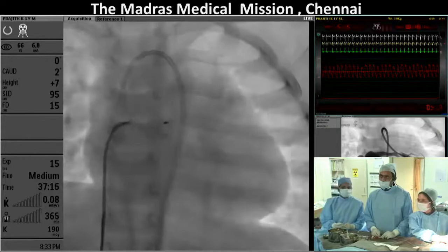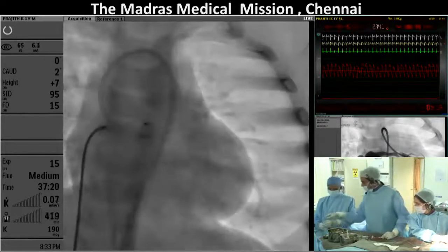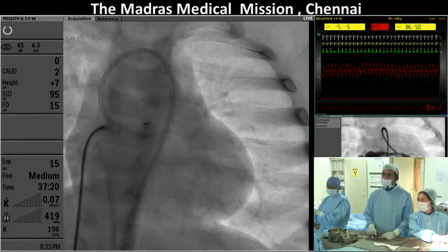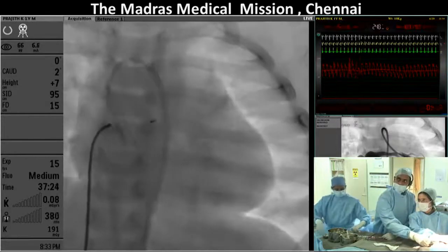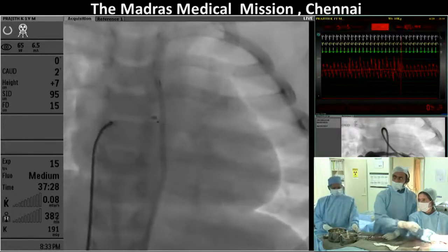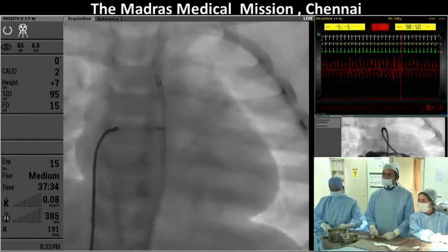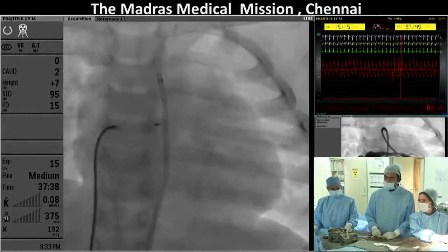I'm getting a coil. That's softer. Okay. Shiva, Jim was suggesting that the aortic catheter be pulled back a little bit. Well, he'll push it with a coil. Well, the aortic catheter is now sitting in the aortic valve. Yeah, it fell out of the left coronary. And it's a big vessel. You're holding the RCA tightly, and that's the kind of catheter with dead space that produces embolic events.